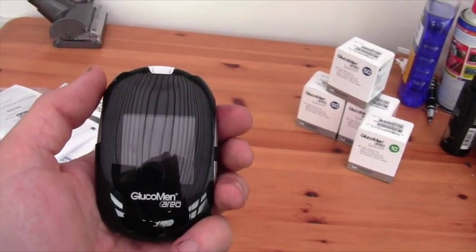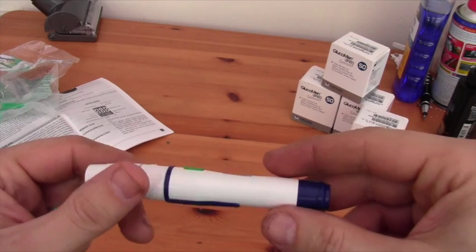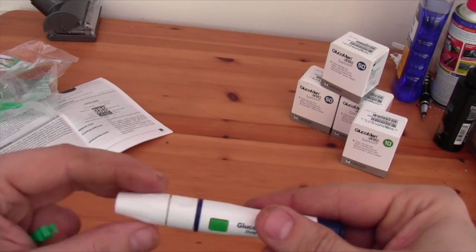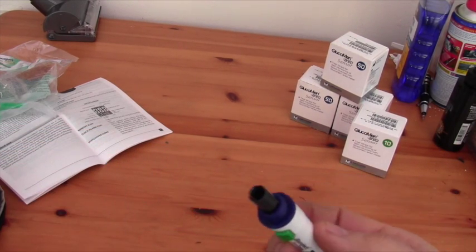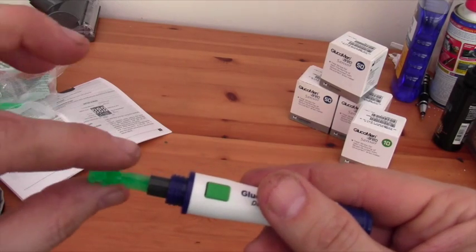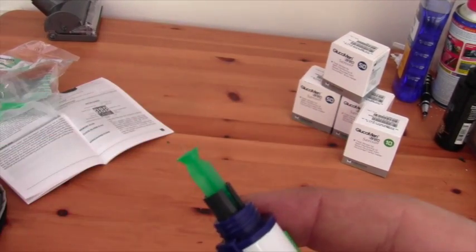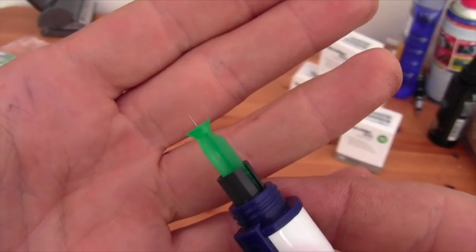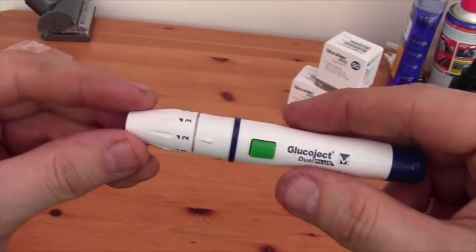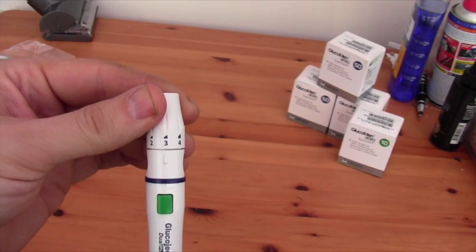Let's move on to doing a simple little test. Here's the lancet device and a lancet. It's quite simple like most others — pull back and push the button. First screw off the top, push the lancet in, then twist off the cap. It is a super fine little needle — one of the smallest lancet needles I've ever seen. Screw back together. I'm going to turn it up to a setting of three because I don't normally get enough blood otherwise.